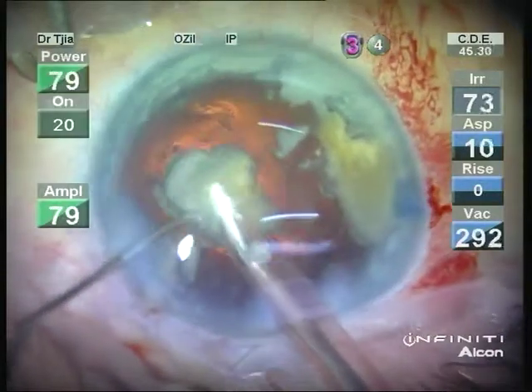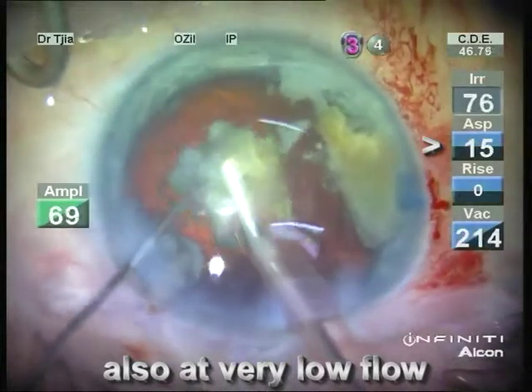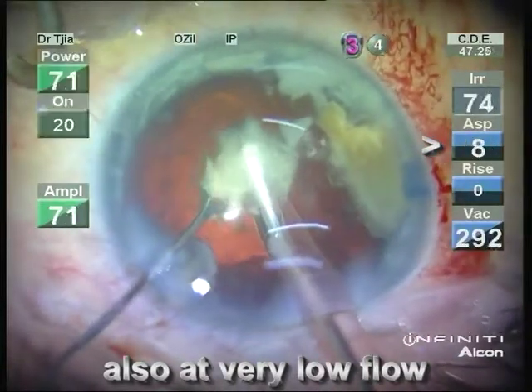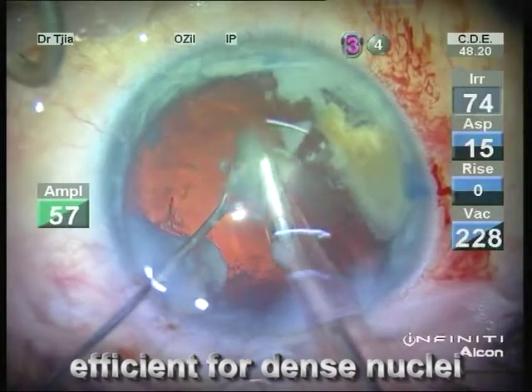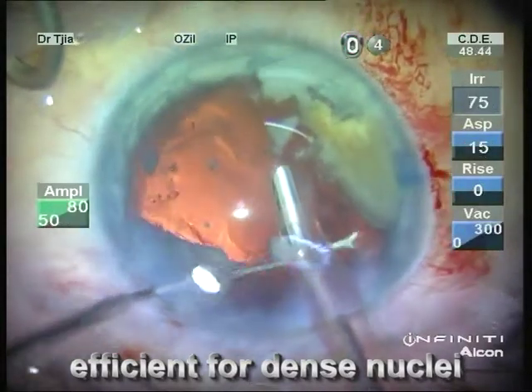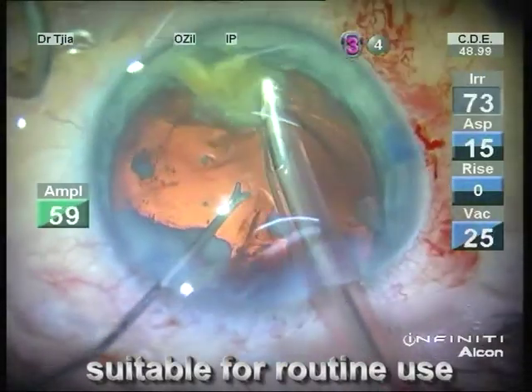This is achieved at very low flow settings of a maximum of 15 cc per minute. Although its efficiency is much more pronounced in dense nuclei, it is also suitable for routine use.